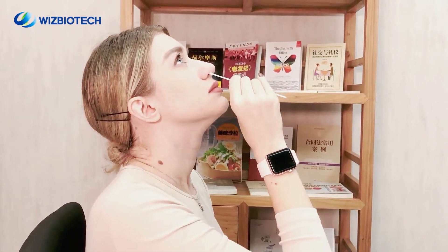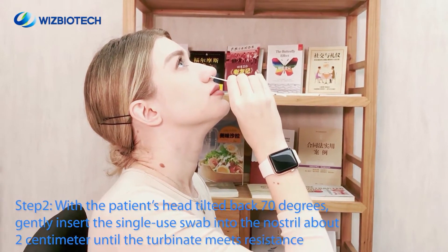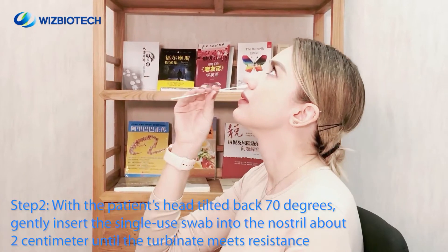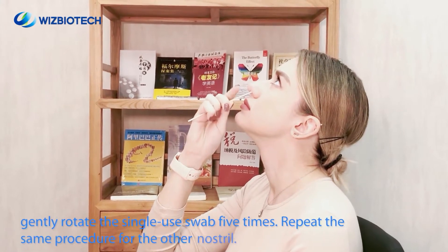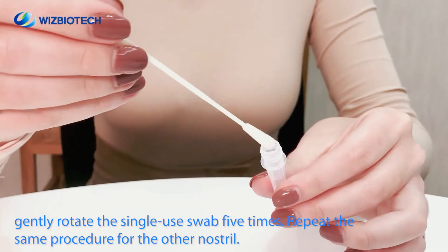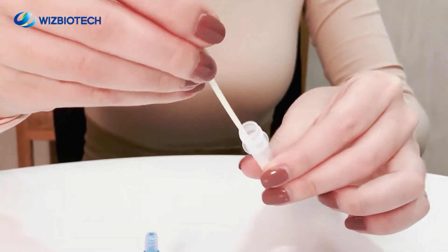Step 2. With the patient's head tilted back 70 degrees, gently insert the single U-swab into the nostril about 2 cm until the turbinate meets resistance. Gently rotate the single U-swab 5 times and then slowly take it out from the nostril. Repeat the same procedure for the other nostril.